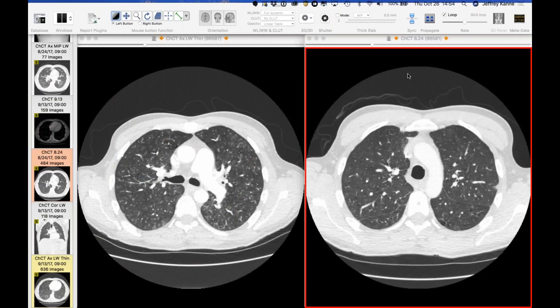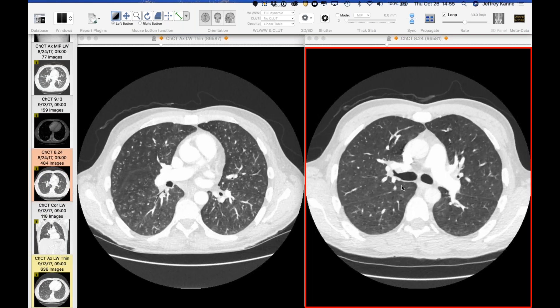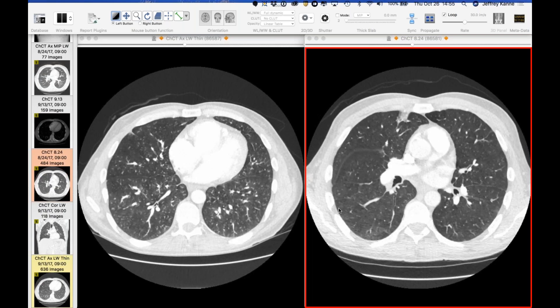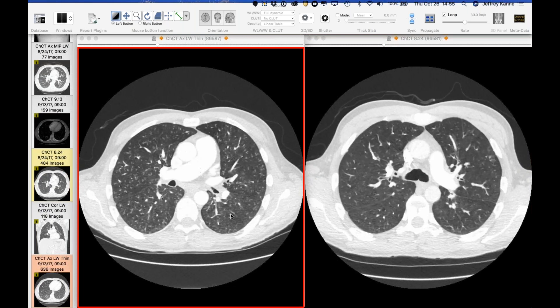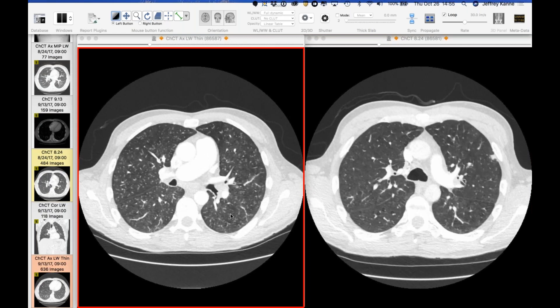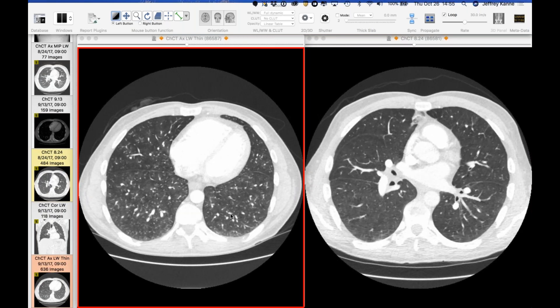This is a case from Julie. This is a guy — we've got two different scans here. The one on the right is the baseline, and this one was done about three weeks later. We've got a smoker with a few little nodules on the original scan, but what's changed is diffuse centrilobular nodules throughout all the lungs — tree-in-bud everywhere. But the important finding: there's acute dilation of the right ventricle with straightening of the septum, even a little bit of bowing.